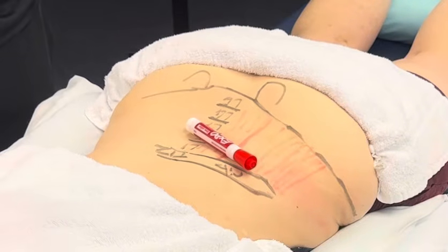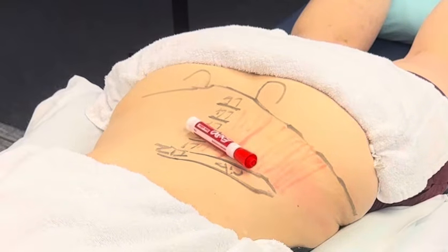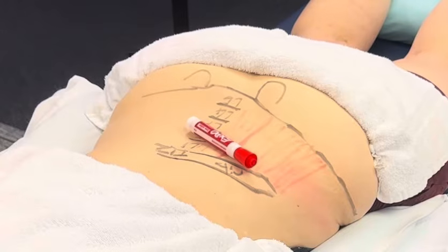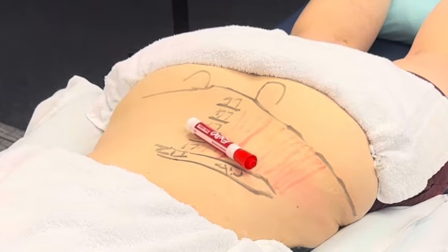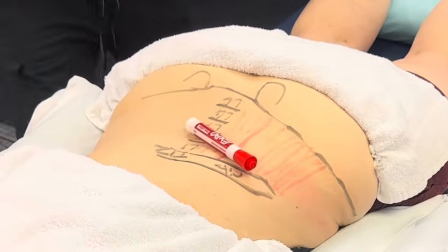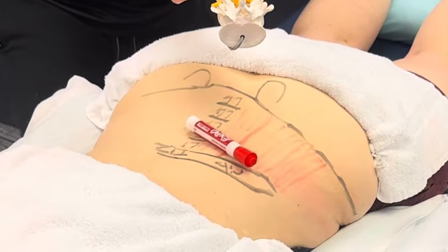You're gonna be surprised. If we put our needle in at the end of the paraspinal muscle bulk, and then we angle it 45 degrees or 60 degrees towards the spine, how far is that needle going in? Like, we're going in like 3 inches, right? On big guys, maybe 4 inches, right? So what's gonna happen is we're gonna come to the end of the paraspinal muscle bulk.